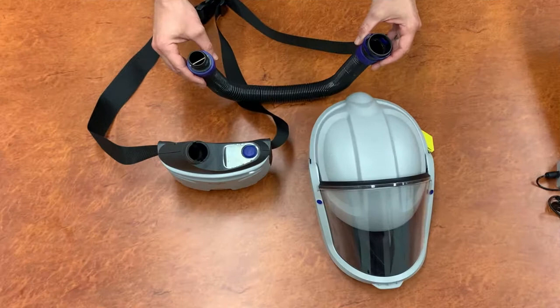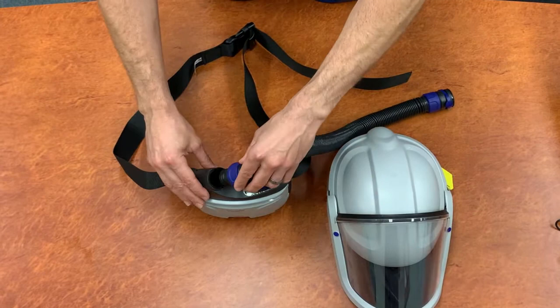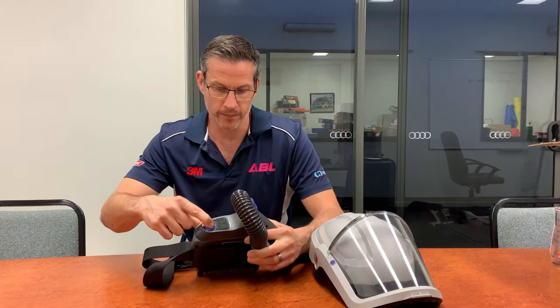You have the three main components of your Versaflow system: the M-series helmet, your air hose, and the TR-300 power unit. To connect the hose, simply insert here and twist. To switch on your power unit, simply press the blue button.